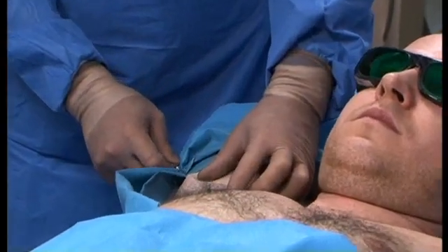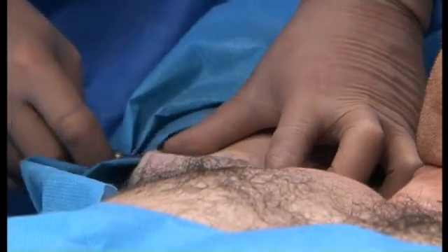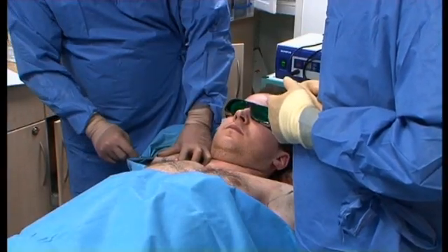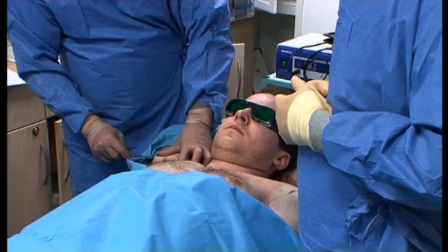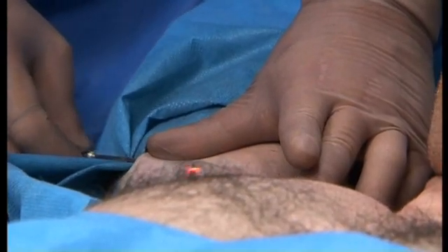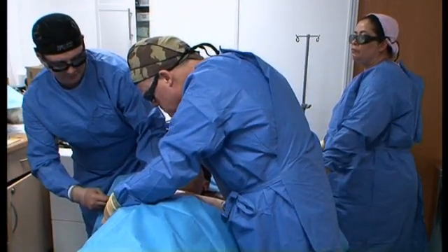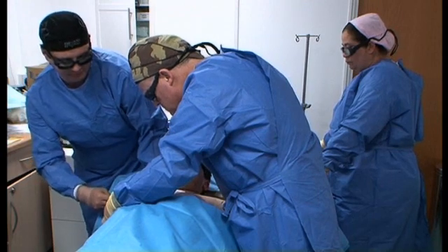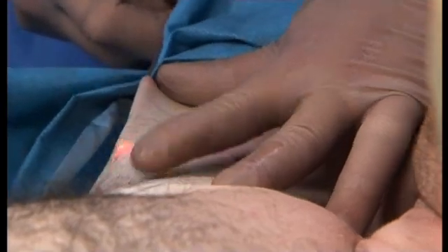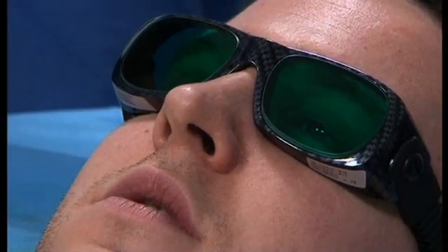You can see the laser through the skin. So what we're going to do is start over here and cover the hottest area with laser energy. We're going to do some sections like this. How's that feeling? Do you feel anything at all? No, no.